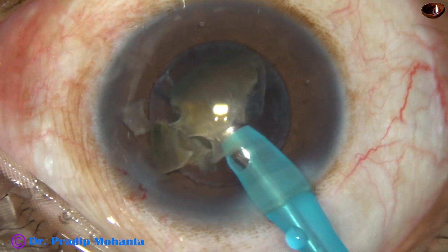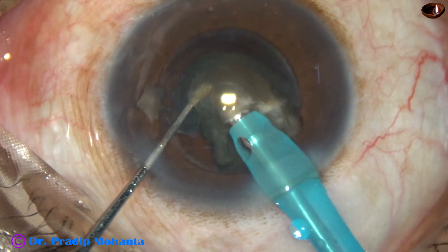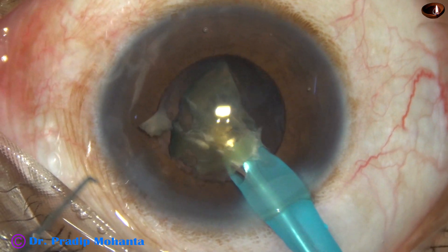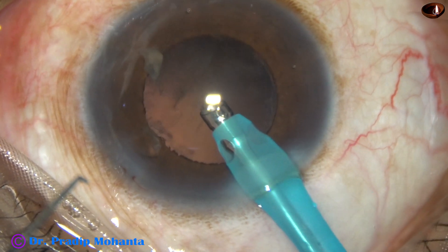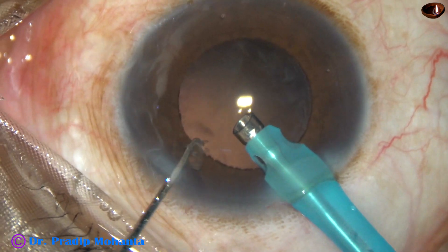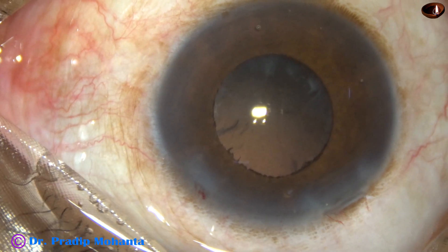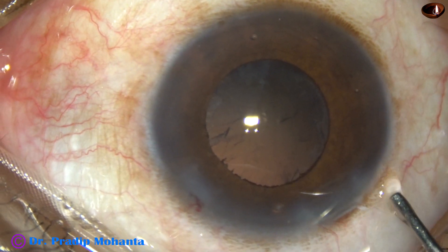In SPEEP mode we can control the vacuum by foot pedal. So even if the vacuum is set at 450 mmHg, we can use only 10 mmHg of vacuum even when the tube is occluded. This acts like a Venturi machine — this SPEEP mode software appears to be very good.